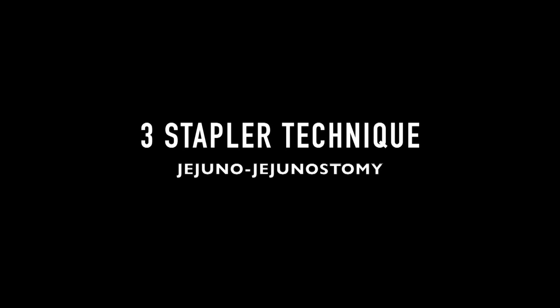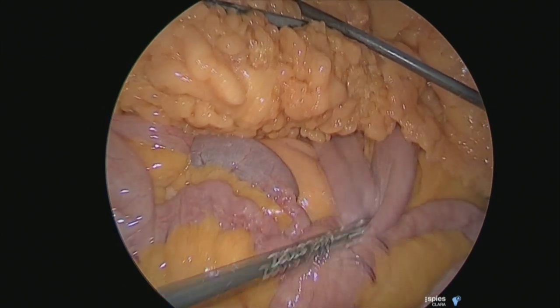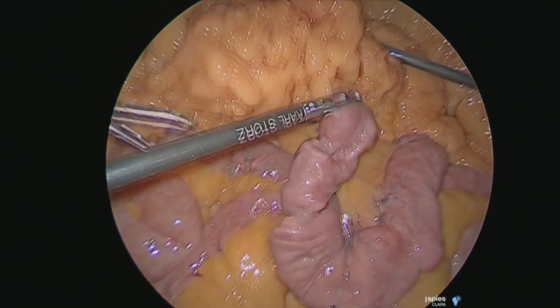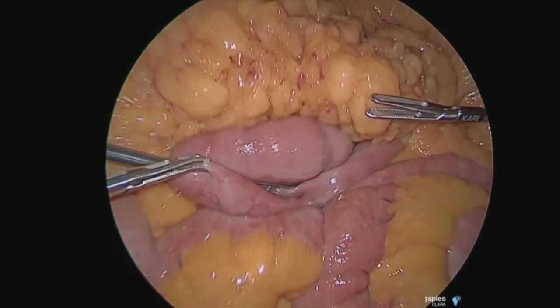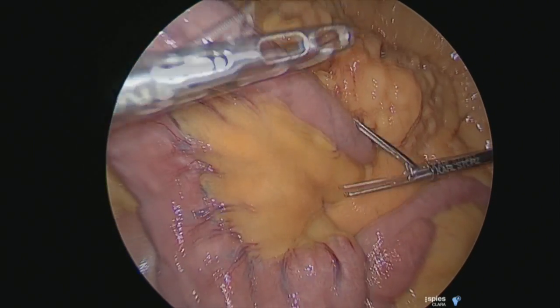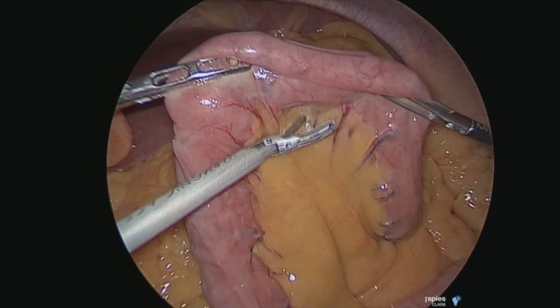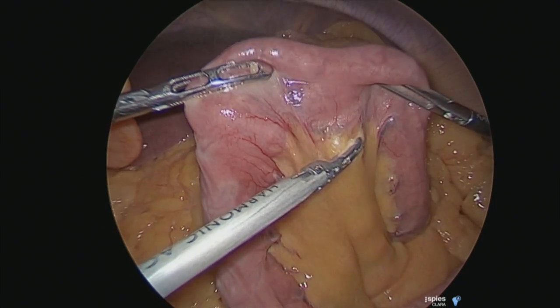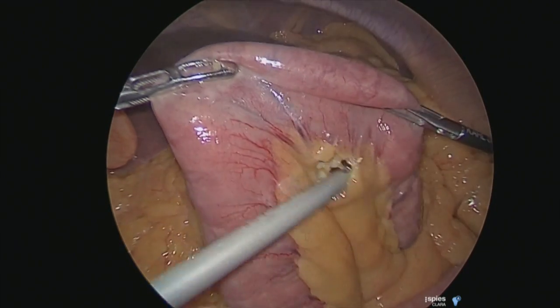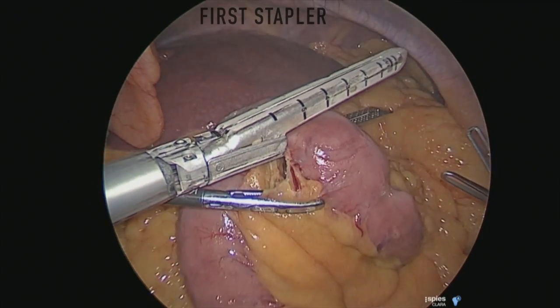This is to show you the three stapler technique for jejunojejunostomies. The first step is to raise the heavy omentum and lift up the mesocolon. Then you identify the ligament of Treitz and measure the bowel for a limb length of around 35 to 50 centimeters. You make a small little window in the mesentery of the bowel and then apply the first stapler.